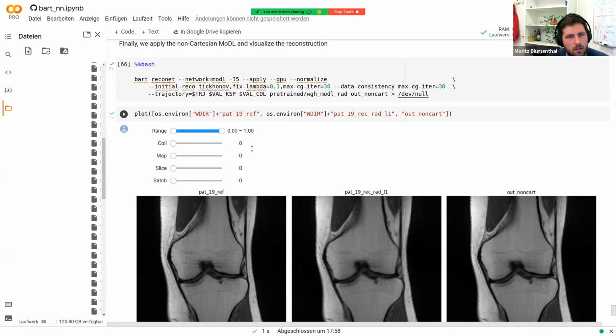So one limitation is that the trajectory needs to have the same overall dimensions, and then the suggestion is that you could zero out some of the spokes. But if the trajectories are completely different with different dimensions, then they would need to be split into different files for training. Yes. Is that correct? Yeah.